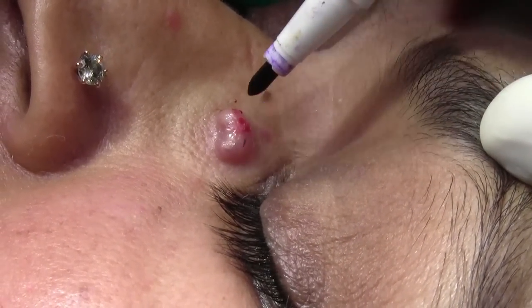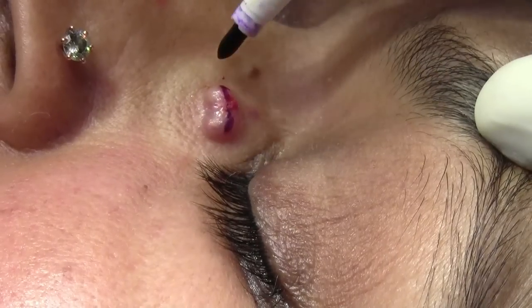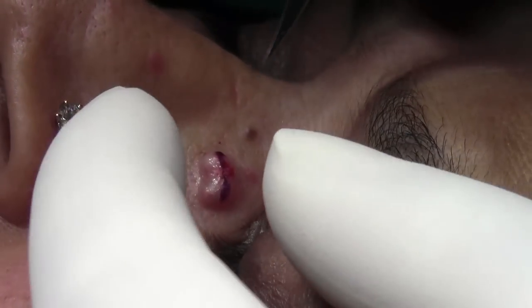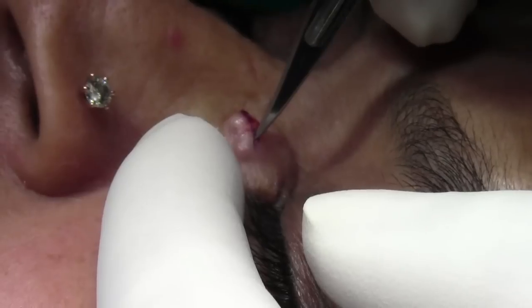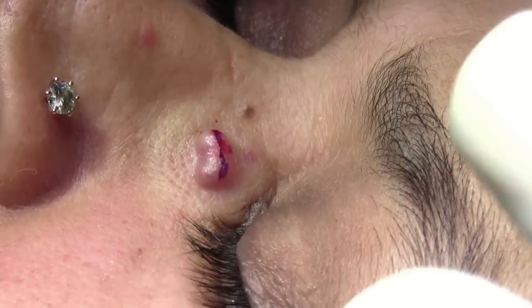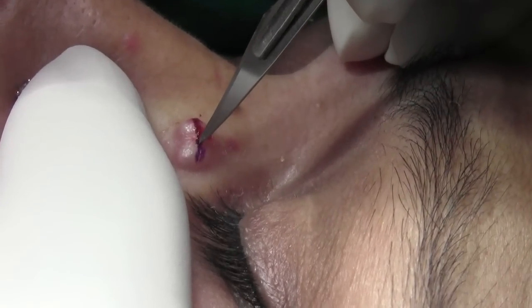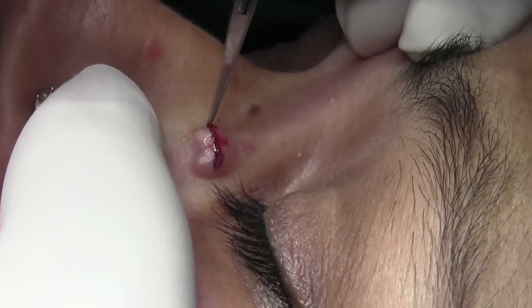I am making an incision — just marking first. I am trying to make a cut here. I am using a number 11 blade, to see whether I am able to remove the cyst in total or if it gets punctured. The wall is very thin, so I stretch it carefully and make the incision, taking care to avoid puncturing the wall.